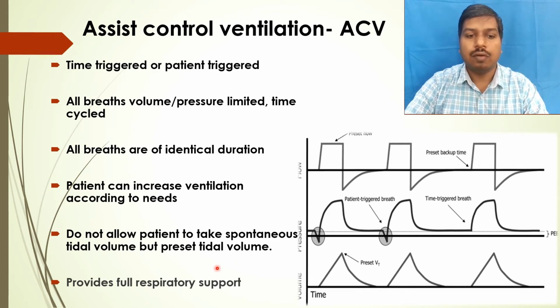It also provides full respiratory support for the patient. But the problem is that when the patient is hyperventilating, all the breaths will be controlled by the machine. So there is a chance of respiratory alkalosis, and the drive may be lost.